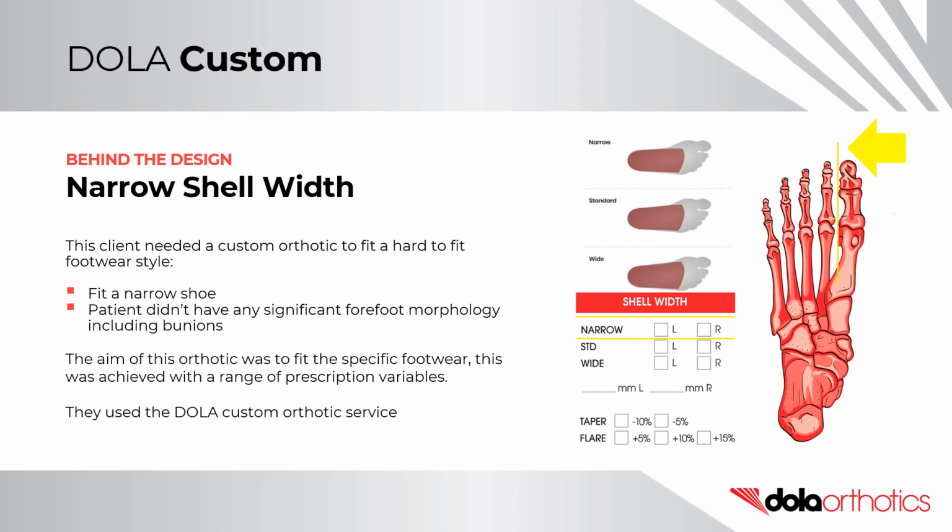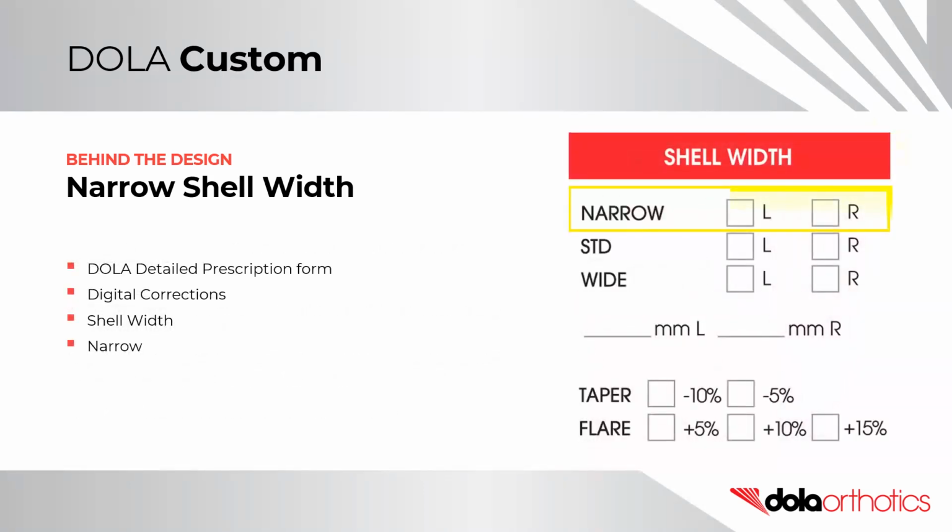This was achieved with a variety of prescription variables. They used the DOLA custom orthotic service. They selected the narrow option from the shell width options in the digital corrections section of the DOLA detailed prescription form.